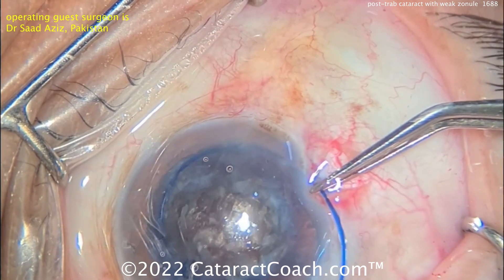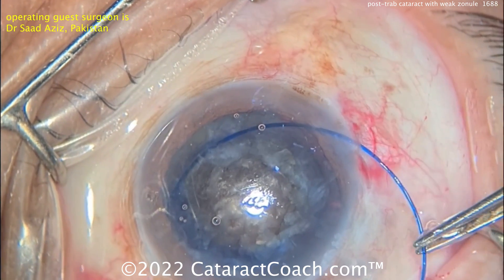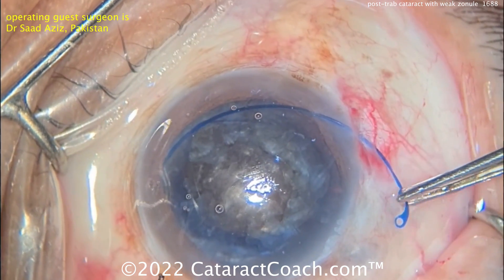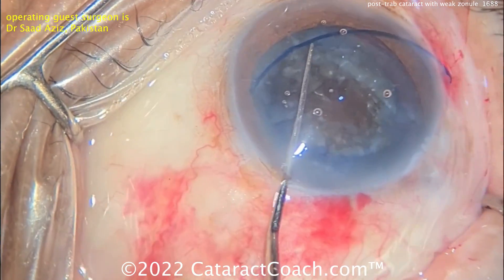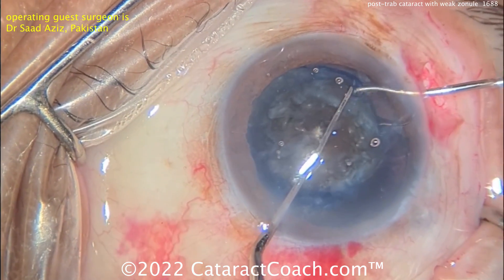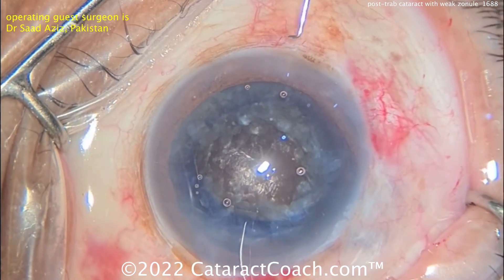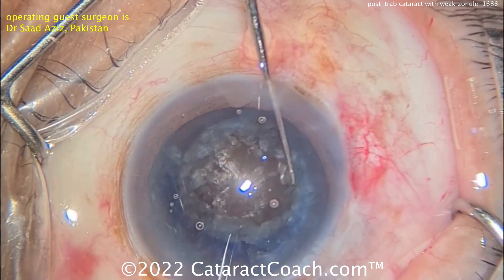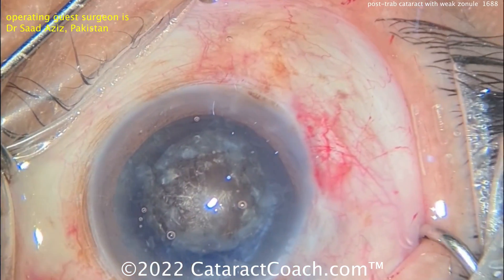Interesting CTR — by the way, we don't have this one in the USA; this is a blue one. Most of the ones we have in the USA are clear. Obviously the color doesn't make a difference, but interesting case. Feeding that CTR inside the eye. That giveaway sign is you should not see the rhexis moving when you rotate the nucleus — the capsulorhexis edge should be pretty still. Getting that end of the CTR into the capsular bag. Now this is going to give you a lot more support during nucleus removal. The catch, of course, is it's going to be a little tougher to get the cortex out. Now look — the rhexis doesn't move as much. The CTR works pretty well here.